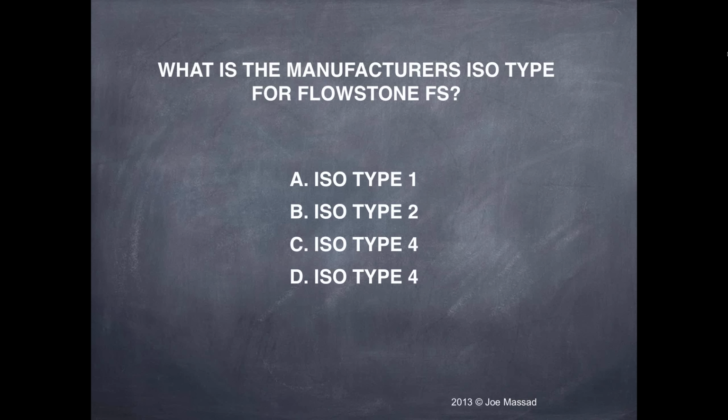Okay? And if it's a flatter ridge, you must use more material. If it's a big ridge, you don't have to use as much stop material, right? So you just want to make sure you calibrate so you don't have a lot of trimming to do. Because if the stops are too large, it means if you have a lot of spillover, you need to trim it just a little bit.